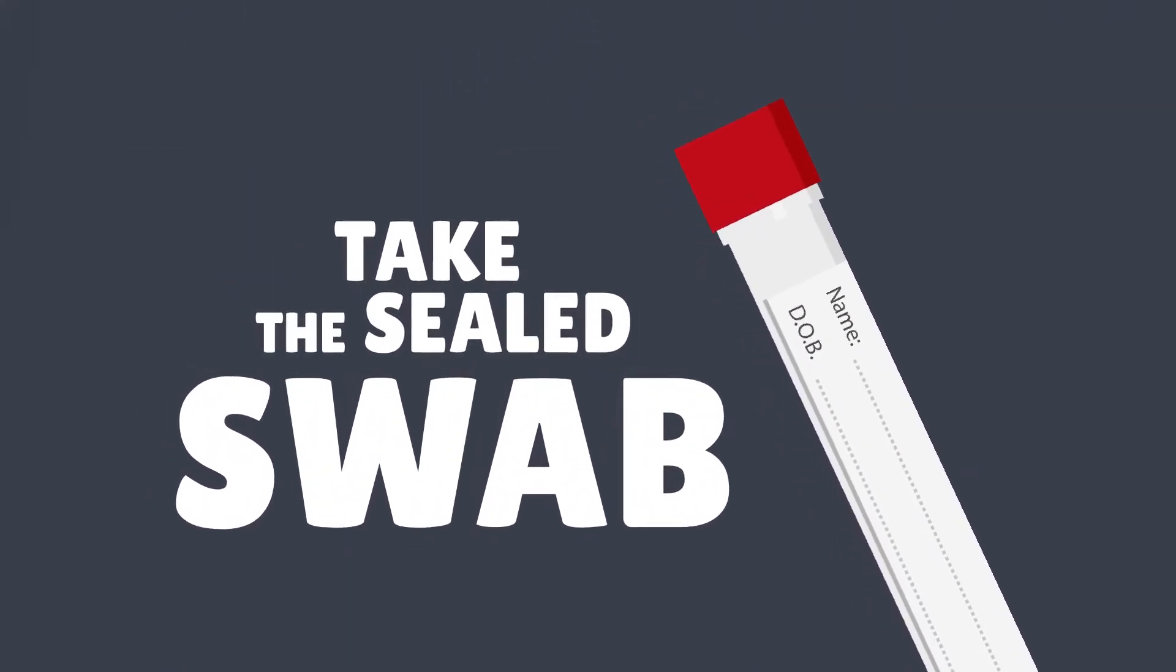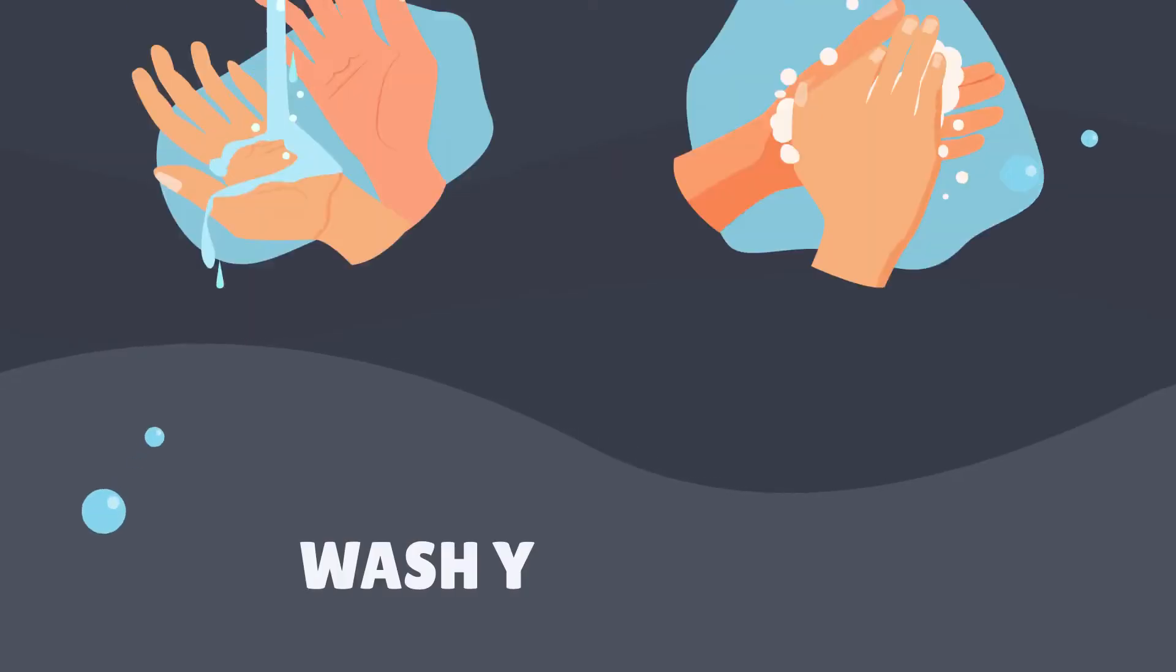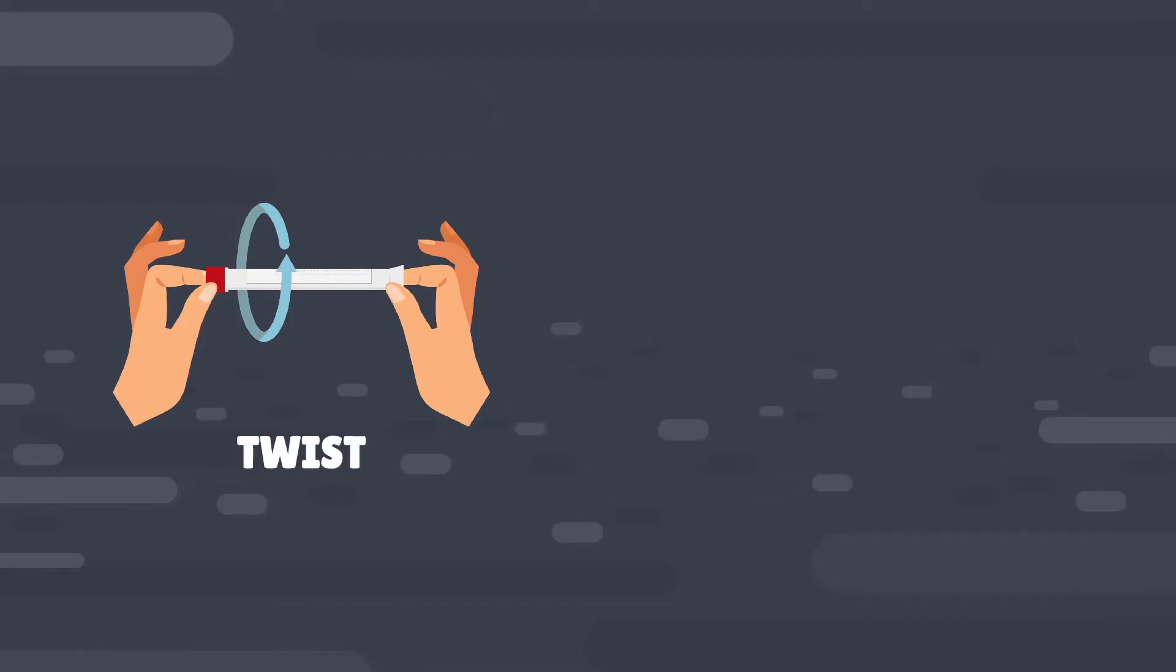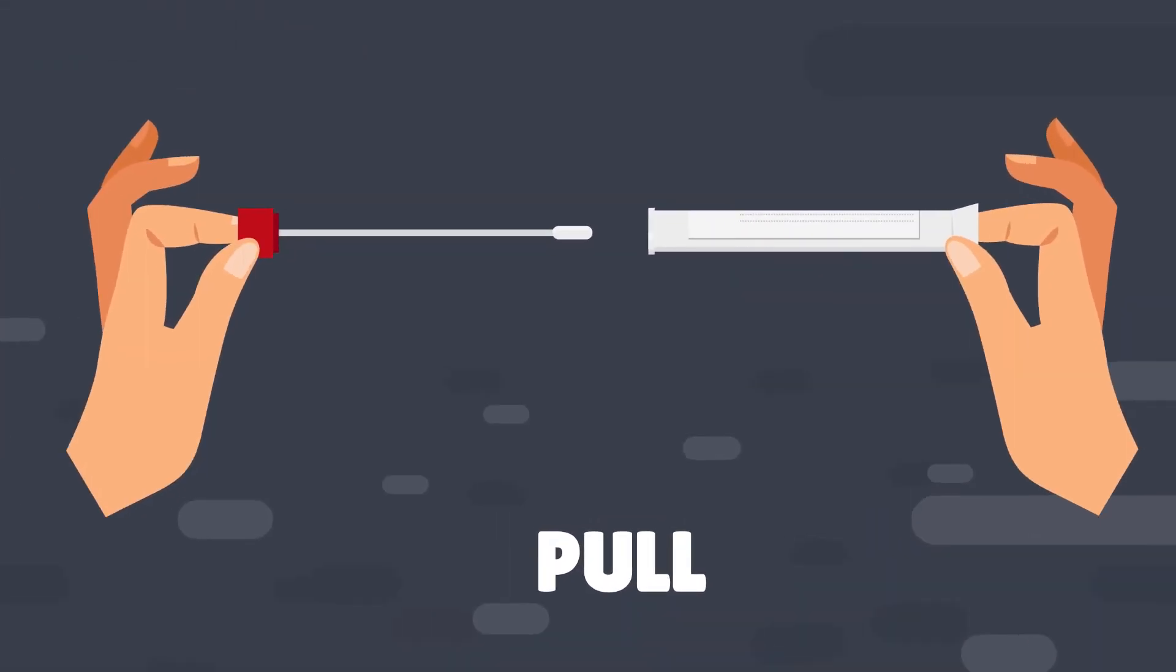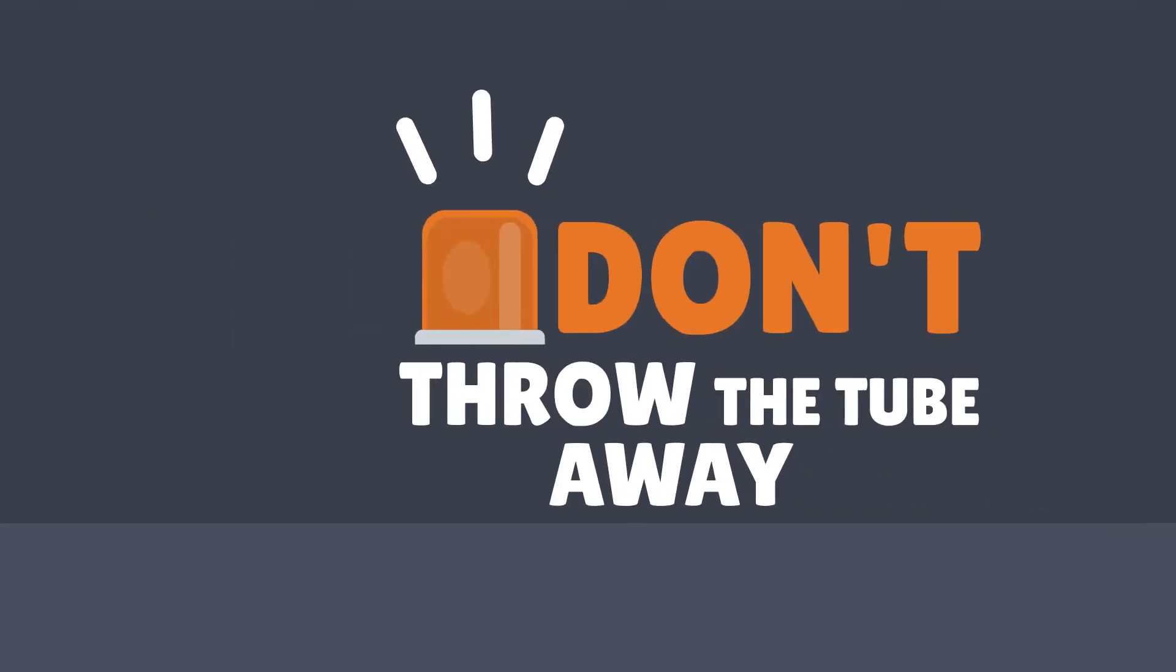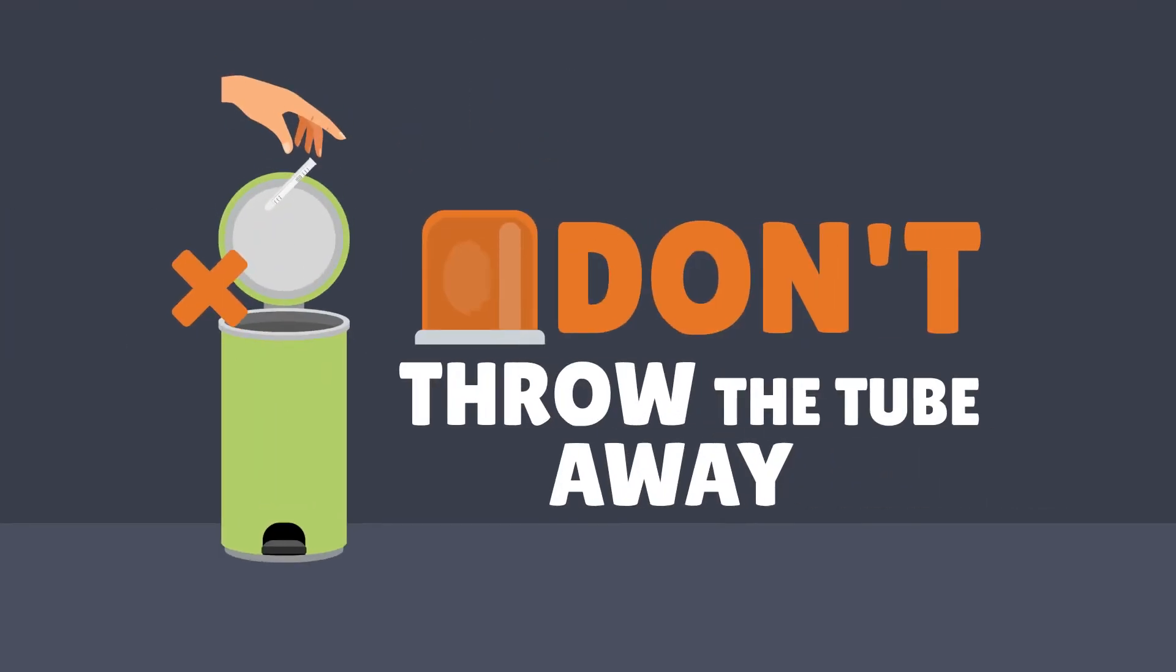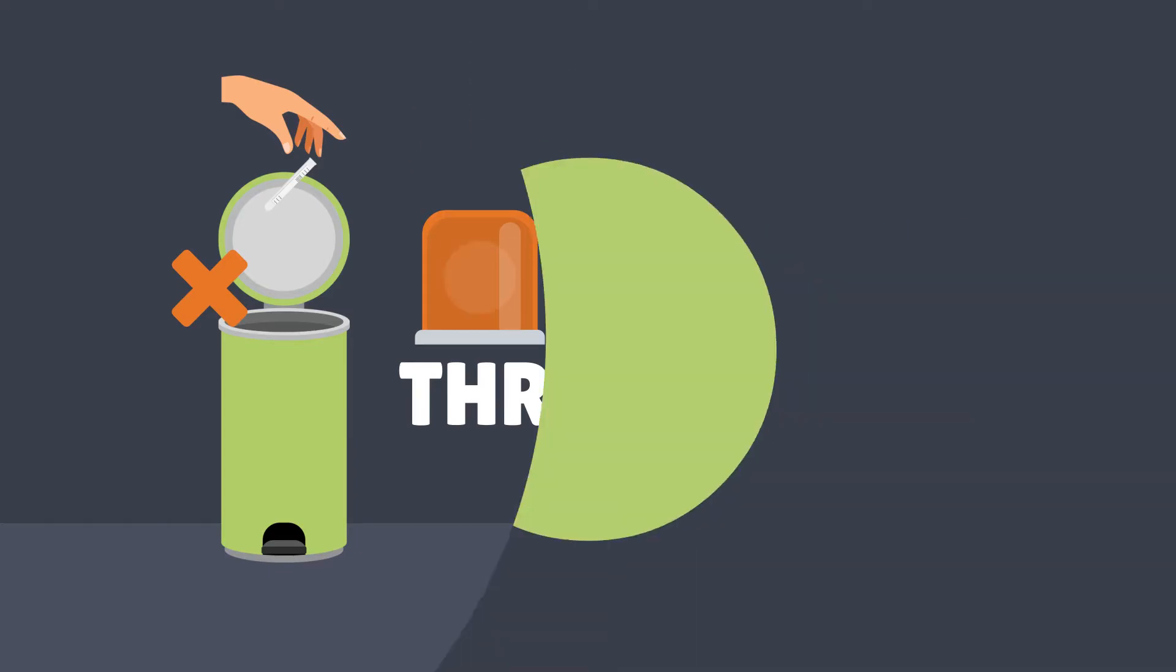Step 2. Wash your hands and open the swab. Twist first to break the seal, then pull. The swab is attached to the cap and stays attached. Remember, don't throw the tube away. You'll put the swab back in after you've collected your sample.